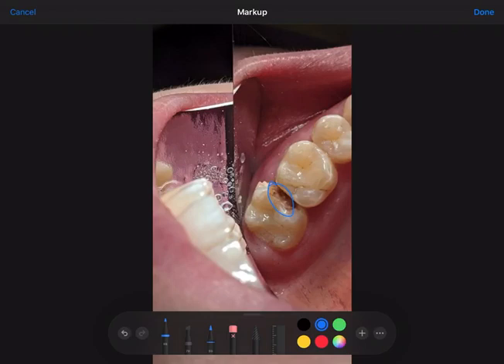What we ended up doing was that this decay is very dark brown, and that's how it looks. When it gets really discolored, there's usually an issue, and we usually look at the tooth next to the one that we're working on as a comparison. You can see a little bit of discoloration here, but this is all very normal. Anyone that drinks coffee will have stains in some part of the tooth like that, but it should never be as dark as what we see in here.